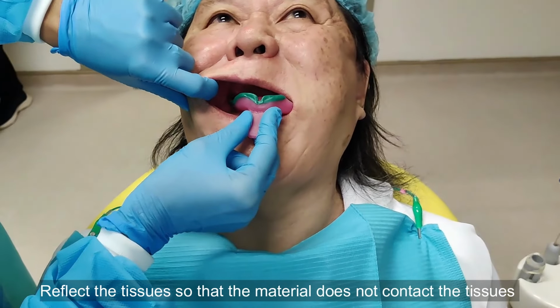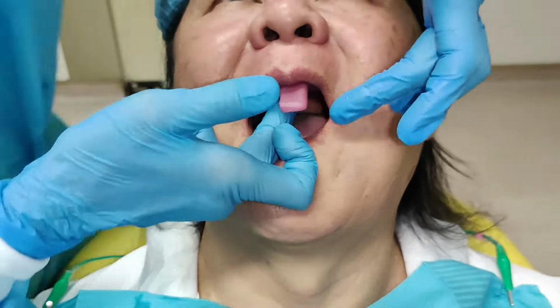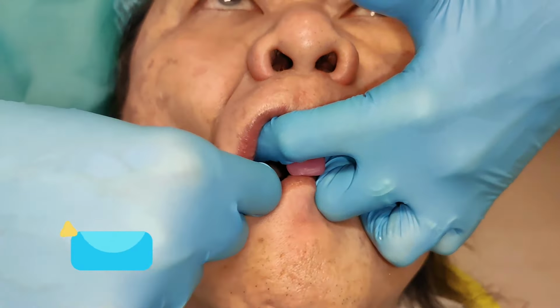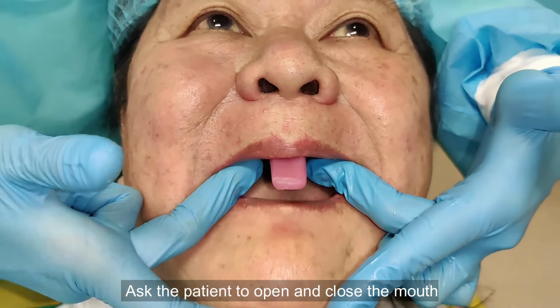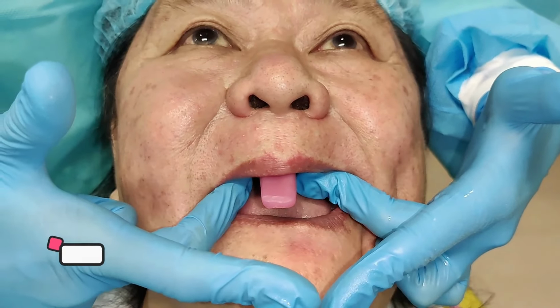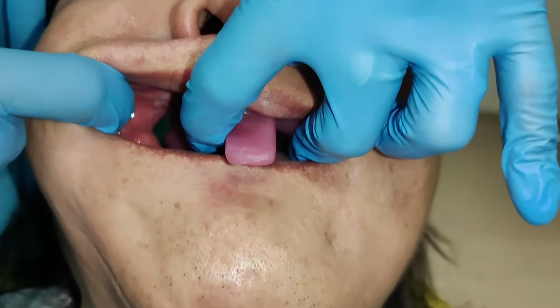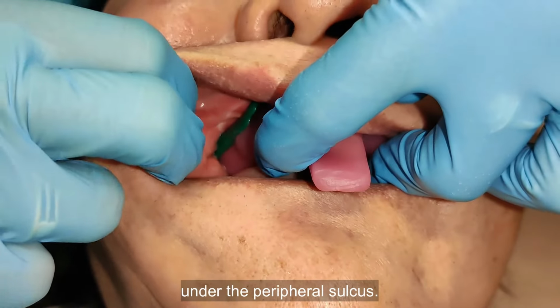Reflect the tissues so that the material does not contact the tissues until it is seated into place. Stabilize the tray with 2 fingers, hold at the modiolus and perform the buccal movements. Ask the patient to open and close the mouth and also perform the lateral movements, that is the right and left. This is to record the distobuccal sulcus, which is limited by the movement of the coronoid process. You can check the extensions whether the material is properly extended onto the peripheral sulcus.